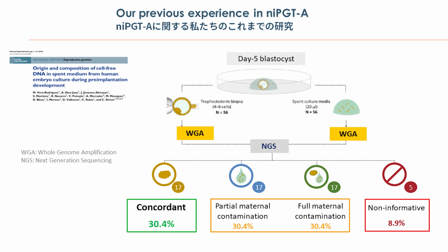Also in this study, we were doing hatching on day 3 because we did this for blastocyst biopsy on day 5. So the embryos had been previously manipulated. The embryos had a hole in the zona pellucida from day 3 to day 5, and the embryos were not especially cleaned to remove the granulosa cells. So in this study, the concordance rate was only 30%. So we were really disappointed. We said, okay, it's only 30%.